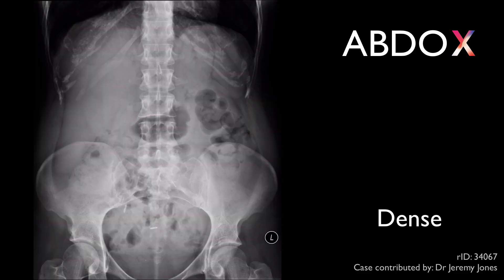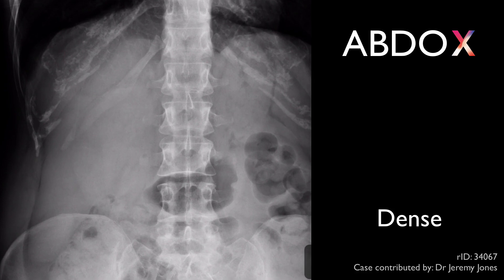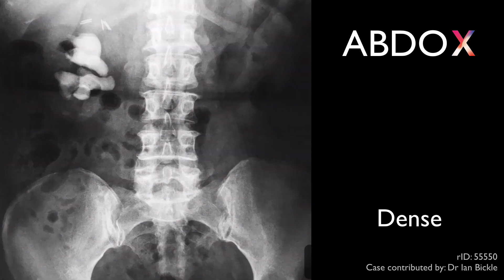D is for dense structures, bones, and areas of calcification. On every abdominal radiograph, examine the pelvic bones, the vertebrae, and the ribs. The costal cartilages often have an odd appearance due to the way they calcify. Renal stones, such as this staghorn calculus in the right kidney, may be seen.